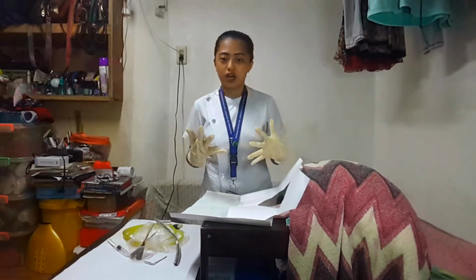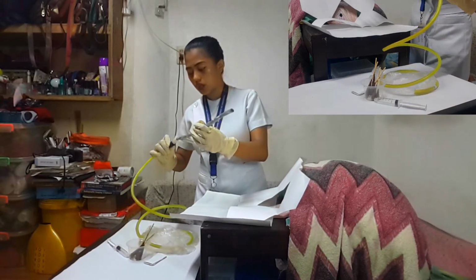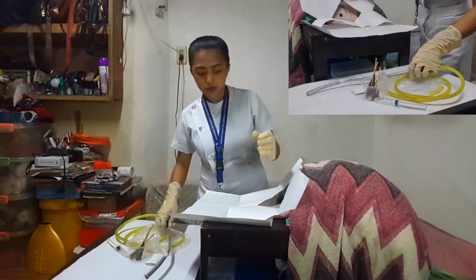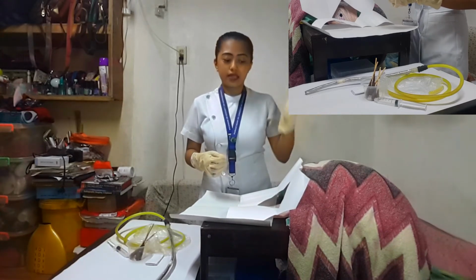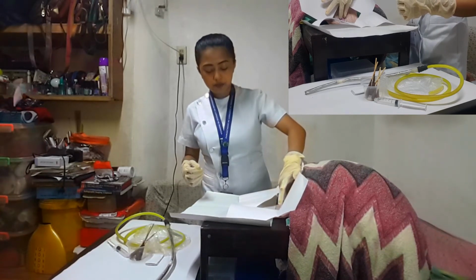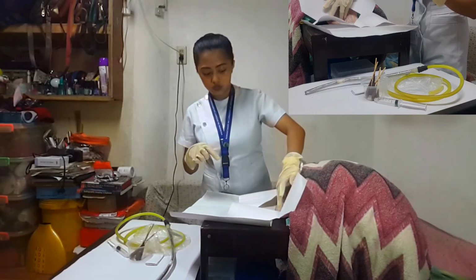Okay, so now we already have our sterile gloves on our hands. We need now to pre-connect the indwelling catheter to the drainage bag or the collection system. The next is we need to expose the labia, and in doing that, we need to place our non-dominant hand on the labia of the patient, and then expose it using the thumb and the index finger. We need to expose the meatus.